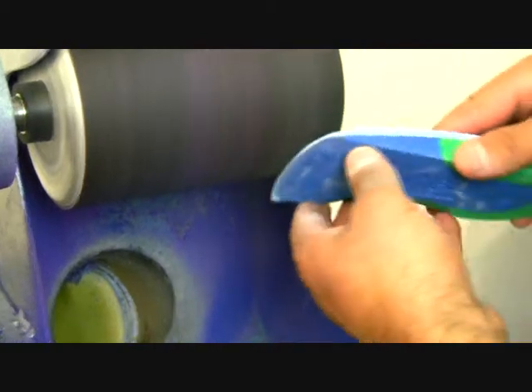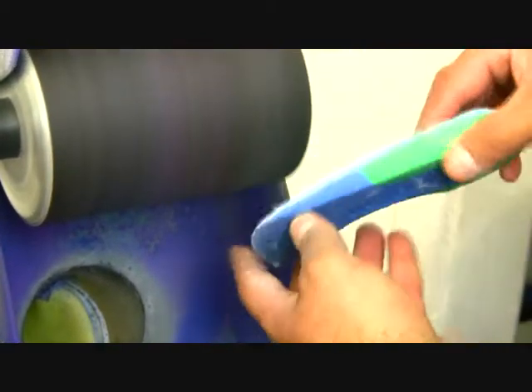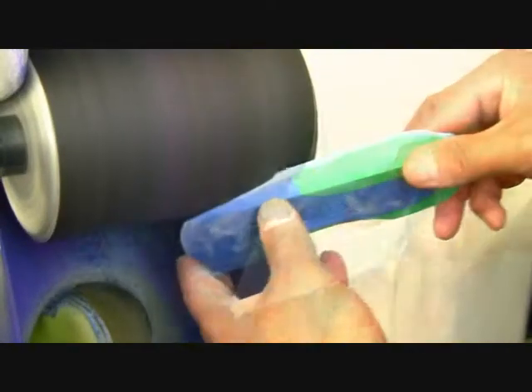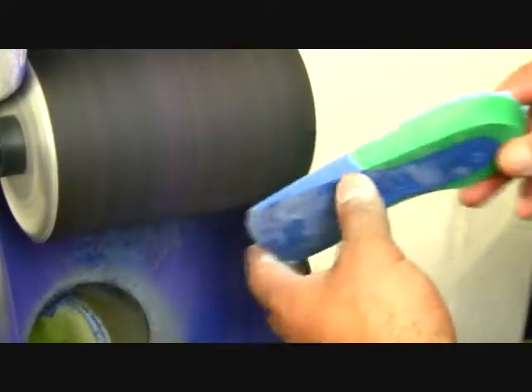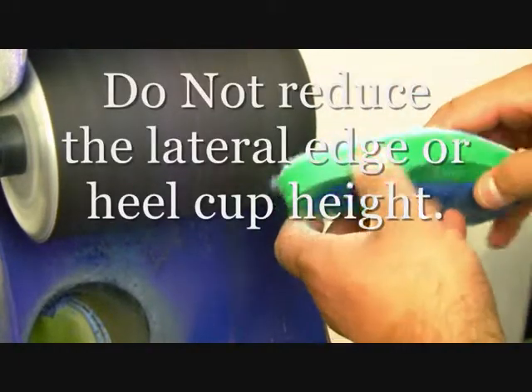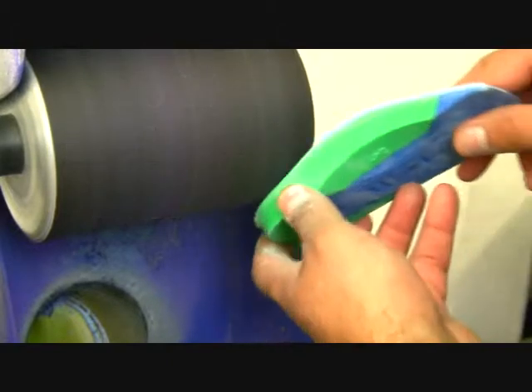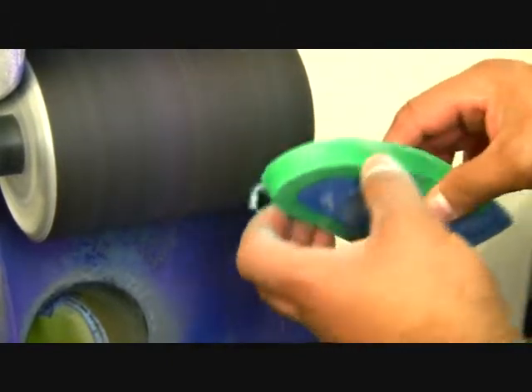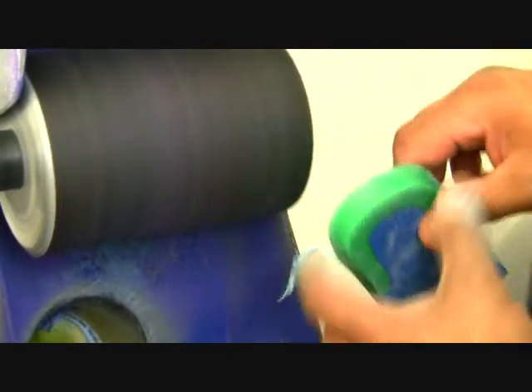Next, the technician is removing bulk from the PPT cover around the edges and distal aspect of the orthotic. Whilst you're completing this step, you must ensure that you do not reduce the height of the EVA lateral, medial or heel cup areas. Just remove the PPT overhang.